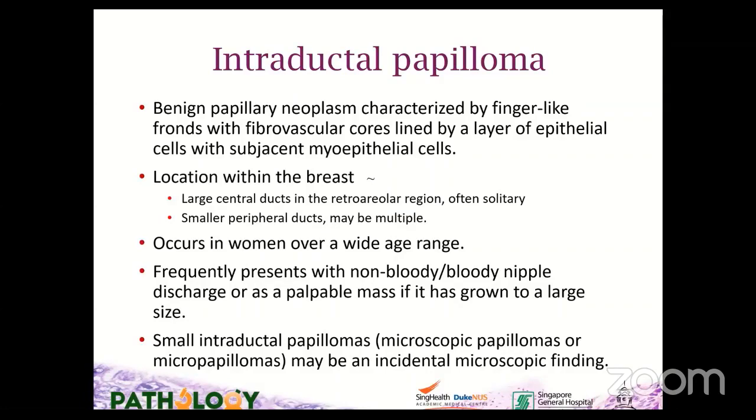The intraductal papilloma can be regarded as a benign papillary neoplasm characterized by finger-like fronds with fibrovascular cores lined by a layer of epithelial cells with accompanying myoepithelial cells.